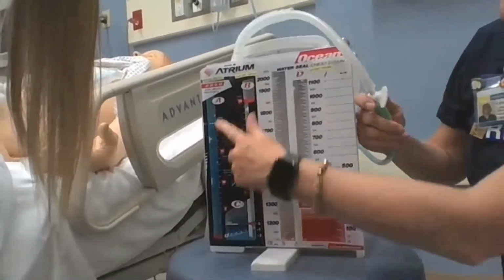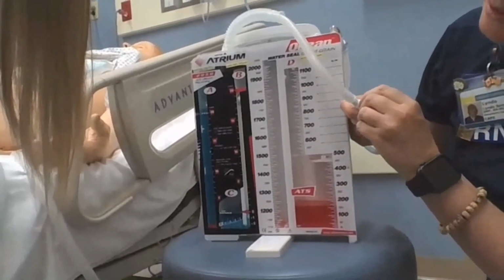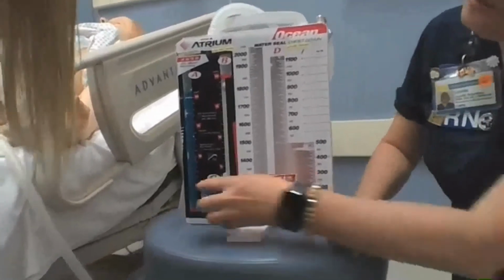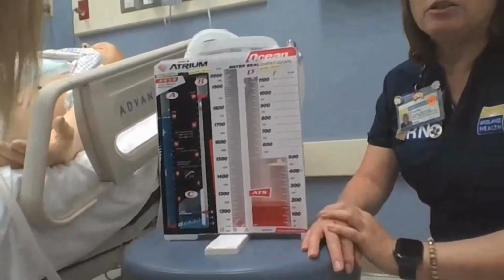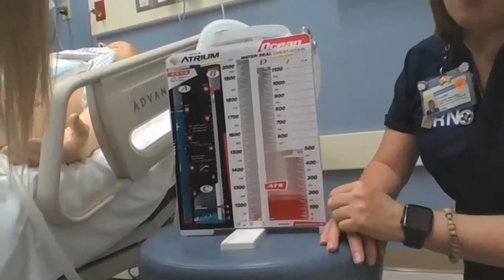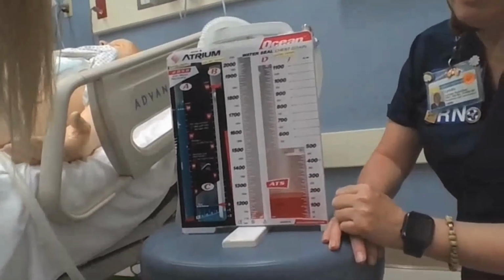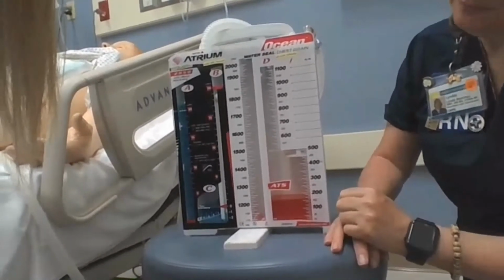Most people think that this amount of bubbling is going to pull more from my patient than that amount of bubbling. And the truth is, it's pulling the same amount. All you need in this chamber is a low, gentle roll. And with the low, gentle roll, you'll actually pull by number of centimeters of water, not by how vigorously the water is bubbling. The only thing that happens when you have vigorous bubbling is that it makes your water evaporate faster and it irritates.